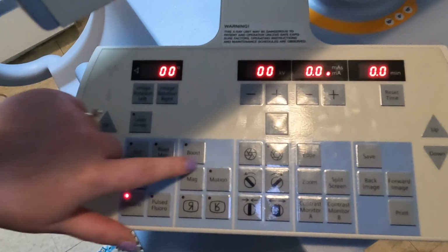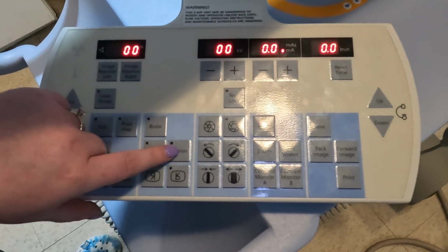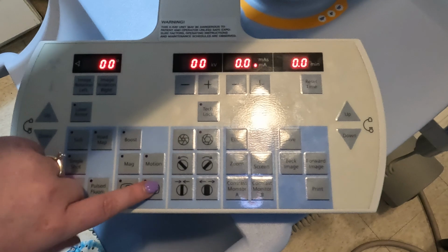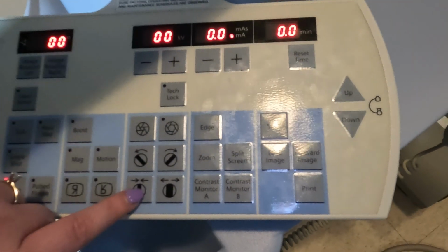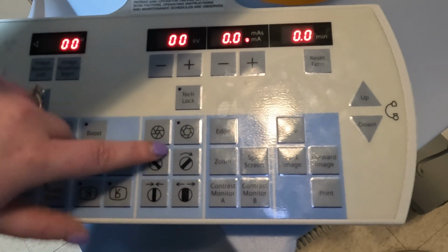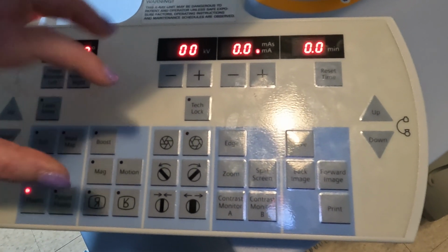Boost is like a boost of technique. And then motion, if you have a lot of motion, like extra breathing, or the patient is twitching, if you shut this off, it kind of uses a breathing technique almost to help with your image quality. Over here is your collimation. So if you want to cone in or cone out, you can cone there. If for some reason your collimation is this way and you need to turn it, you use these ones right up here. The ones up top are coning collimation, so it'll cone down like a circle.